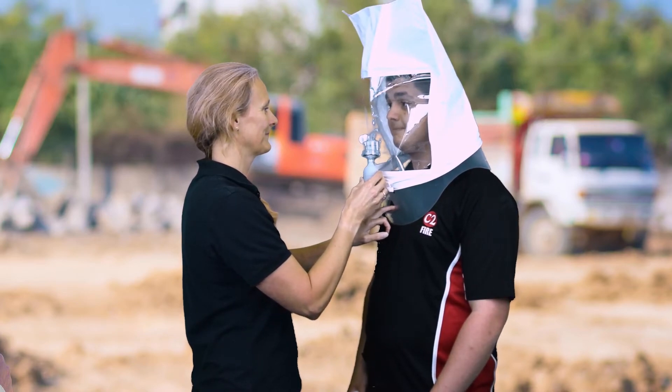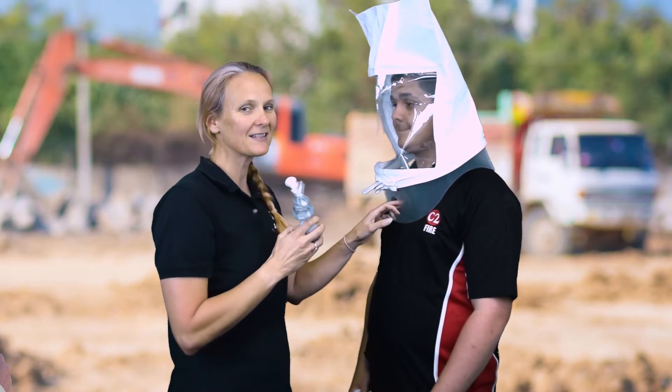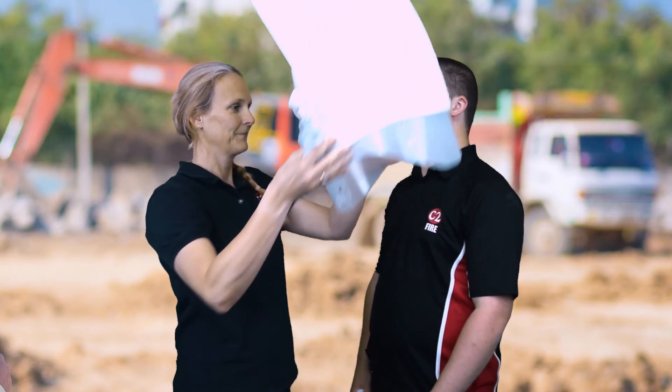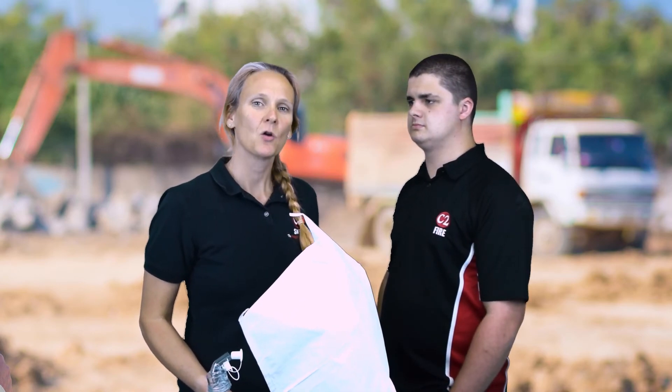I can taste it. Wonderful — so that's seven pumps. I can remove the hood now, Tom. The next stage would be to repeat the test with Tom wearing the face mask, but really this needs to be done face to face with your safety advisor. So for the purposes of training, we're going to stop here.